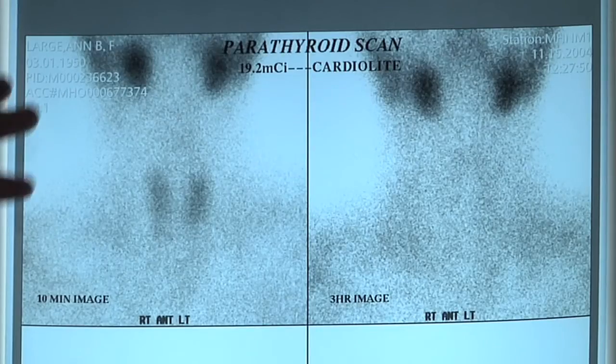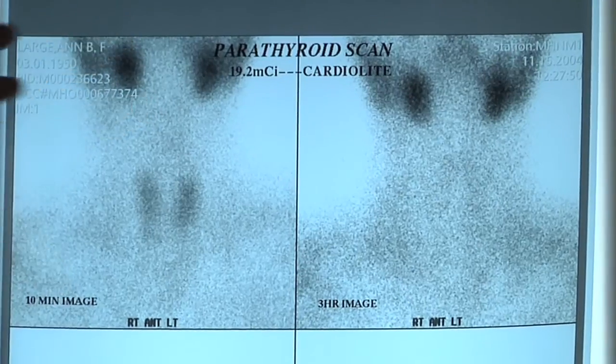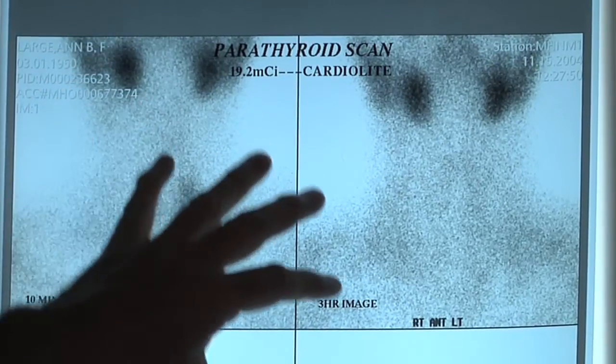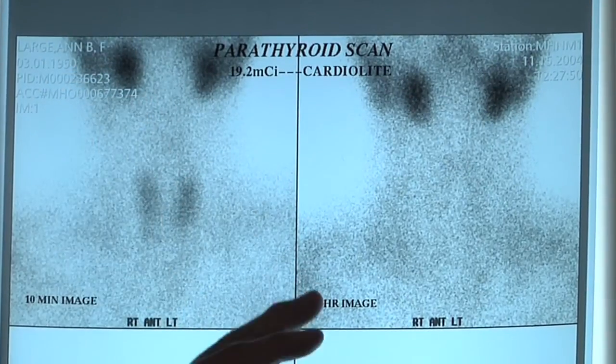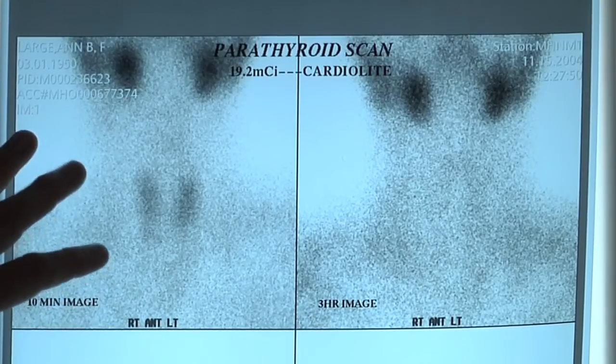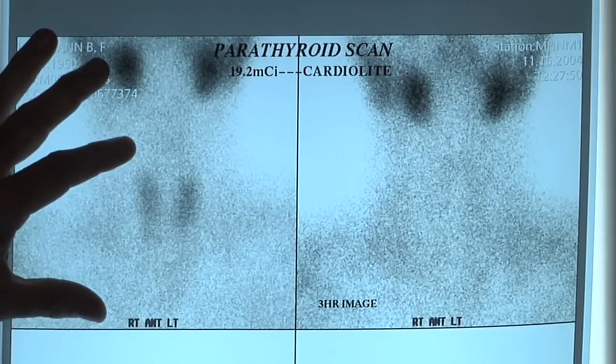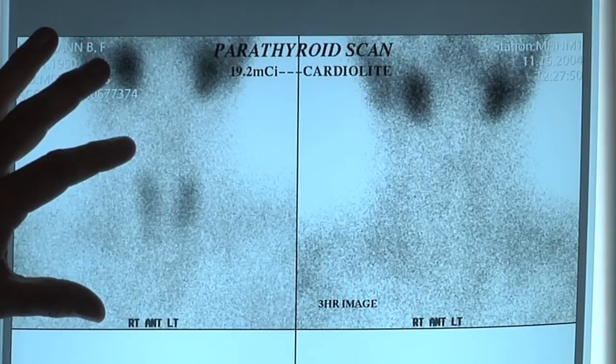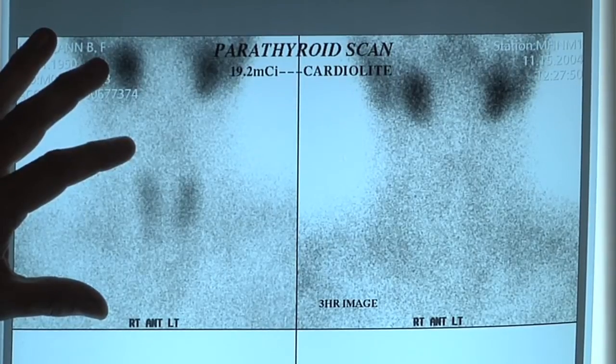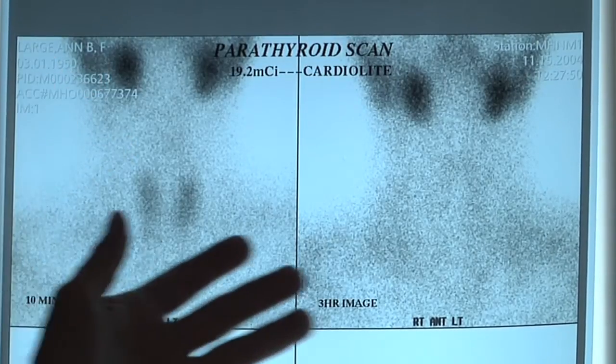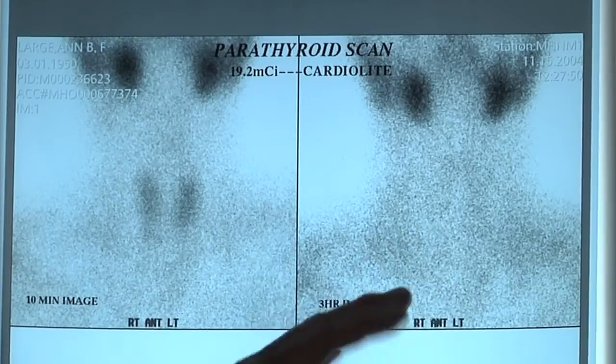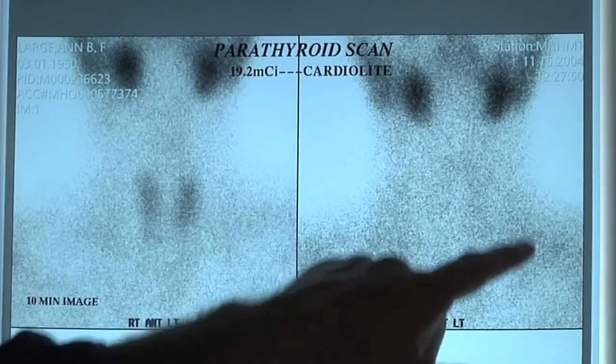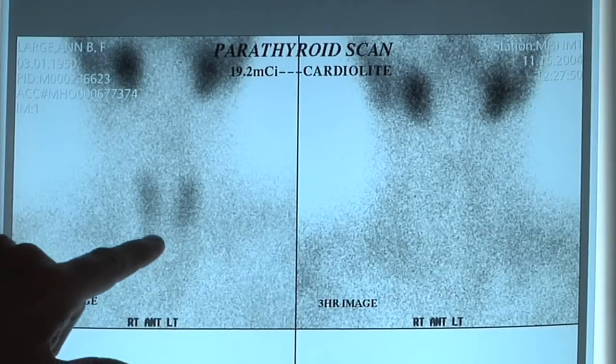The first example we have is this scan right here. The scan should be very clean, crisp, and in focus. This particular patient came to us after already having a failed parathyroid operation. They had an operation that took several hours, didn't find the parathyroid tumor, and this is the scan that she had prior to her first operation. Notice it's blurry. It's not in focus. You can't even really see the thyroid gland.